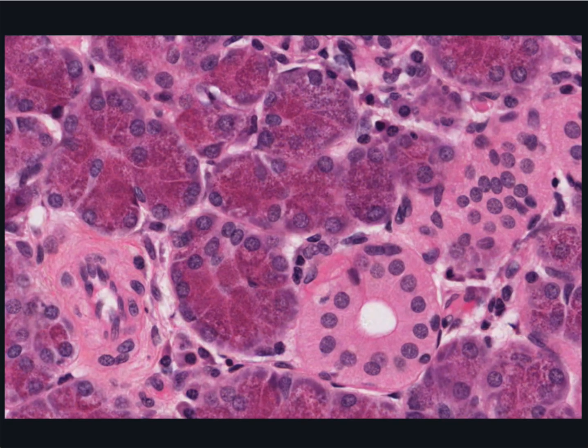The acidophilic intralobular ducts are striated ducts, lined with a simple cuboidal or columnar epithelium. Note the eosinophilic cells which line them. Their staining characteristics come from their large numbers of mitochondria for pumping ions into and out of their lumen. These ducts have the important physiological function of regulating the ion content of the saliva. They're not just passive pipes to the surface as the excretory ducts are.